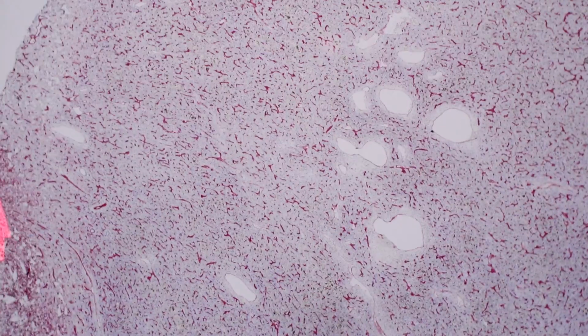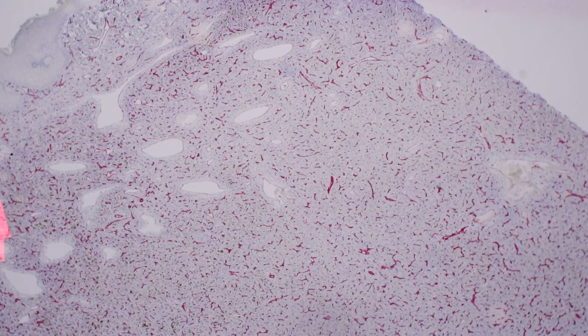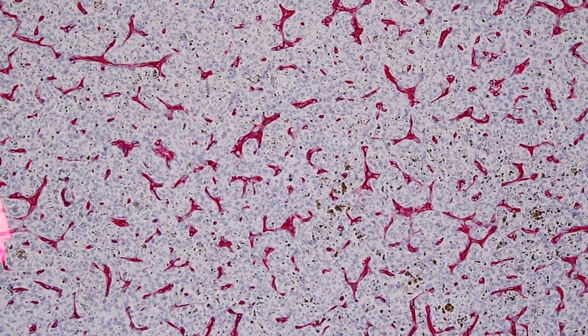And again, this case to me is incompatible with DFSP, but if you were concerned about that, a CD34 stain could potentially help. And you have to be careful though. CD34 here, this is a great example of nice negative staining. Now you might say, well look, there's a lot of stuff staining there, but look what that is. Those are all the vessels in the background. Be really careful.